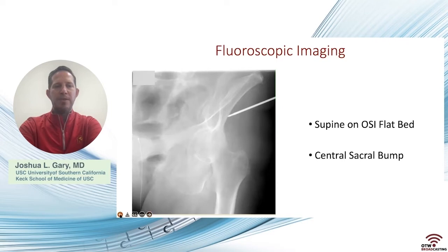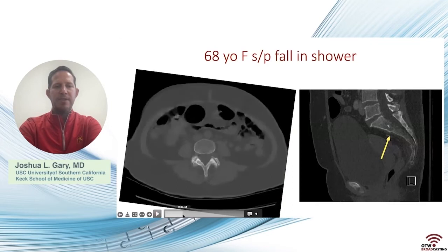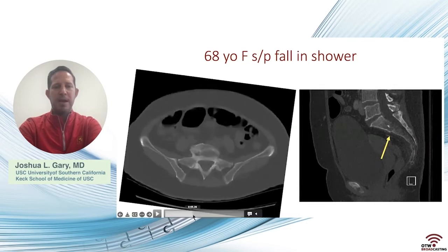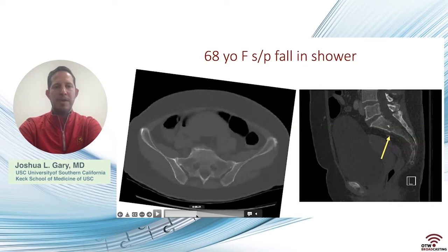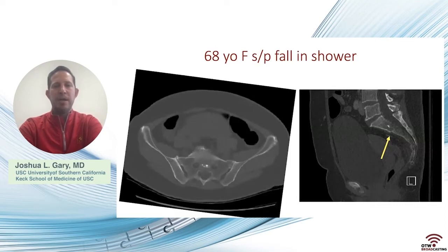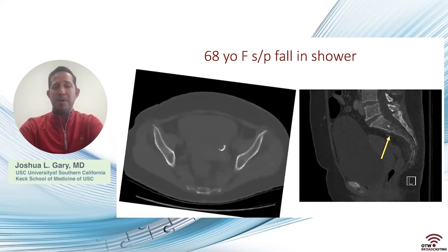I think the one other thing that's notable, if we go back on her CT, is we like transsacral transiliac fixation for these because we're really trying to stabilize the central sacral segment and the entire upper body and spine back to bilateral lower extremities. But here she's got some dysmorphism, so there's not really a pathway for a transsacral transiliac screw in the upper sacral segment at S1 above the transverse component. And so, that in the past may be an indication if you're doing surgery, you can just try bilateral SI style screws, but it may also be an indication for lumbopelvic fixation.